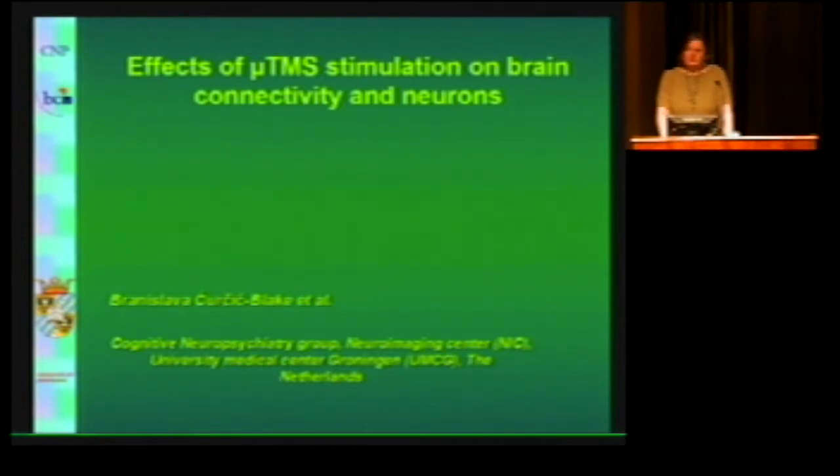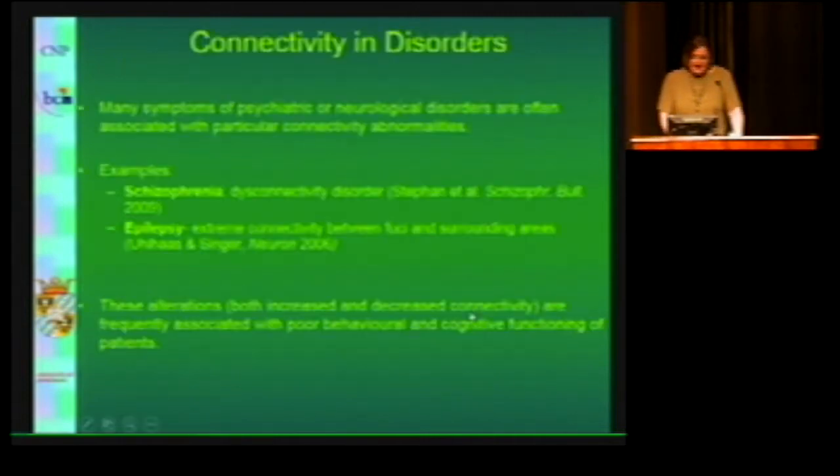I will talk today about our finding, our novel stimulation technique. We call it micro-TMS. The novelty is in the way it is applied to the brain, but the technique is also known as low field magnetic stimulation. Yesterday Peter Bandentini talked about this, and in the literature it is also known as PEMF, which is pulsed electromagnetic field stimulation. The idea is to apply this technique to change brain connectivity.